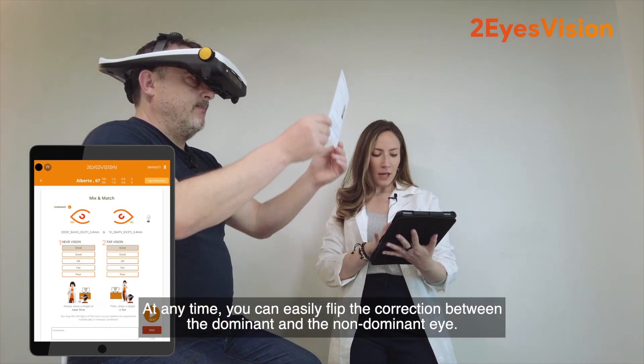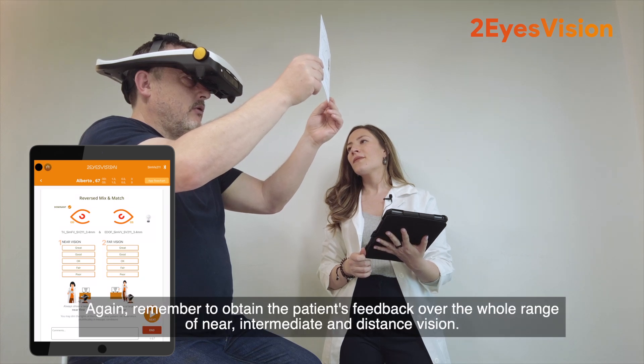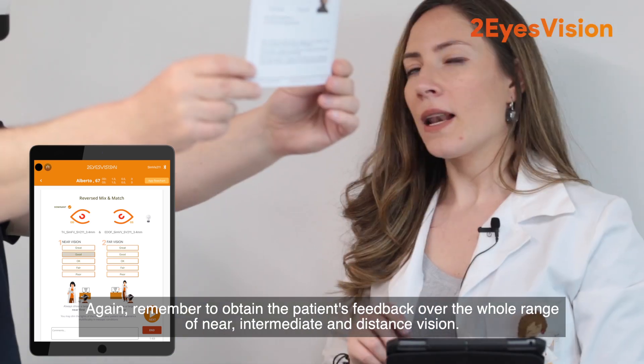At any time, you can easily flip the correction between the dominant and the non-dominant eye. Remember to obtain the patient's feedback over the whole range of near, intermediate, and distance vision.